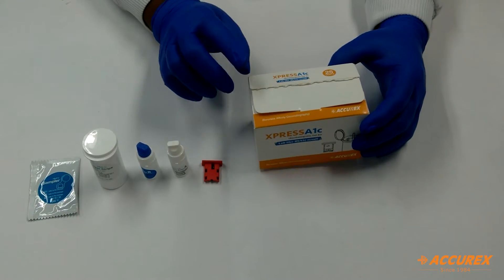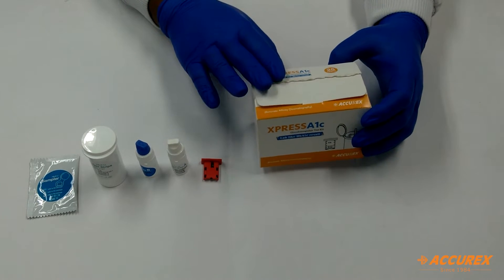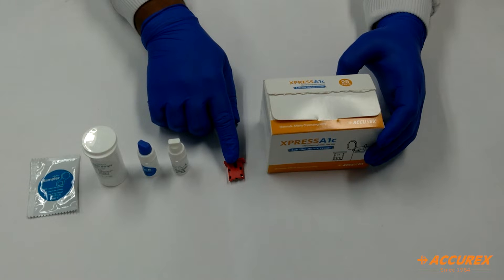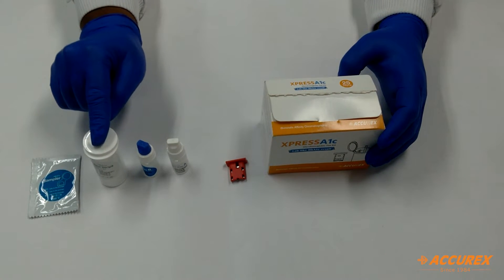The second box — you can see this is the Express A1C test kit. In this kit, we can find these components: first is the calibration chip, second is Buffer A, Buffer B, test strips, and sampler.